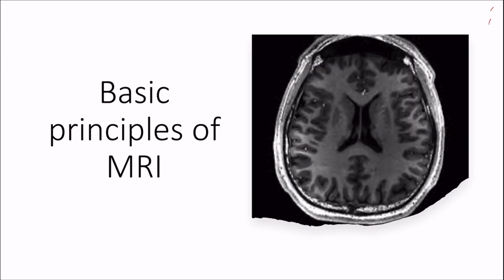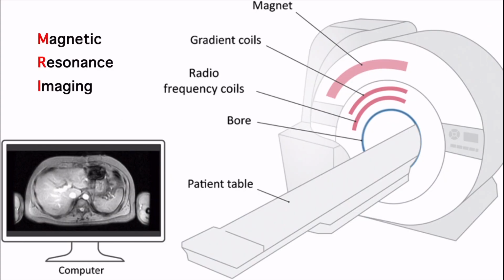In this video I will explain the basic principles of an MRI. Well, we first start off with what is an MRI. MRI stands for magnetic resonance imaging.